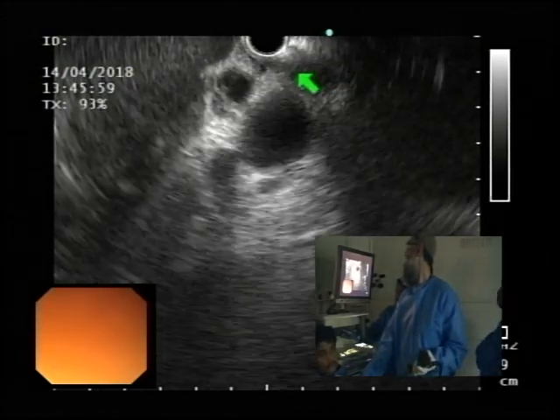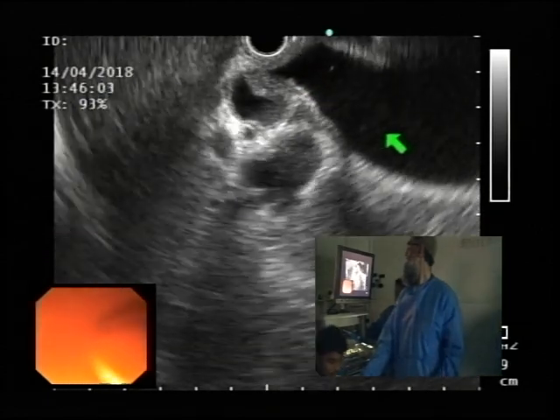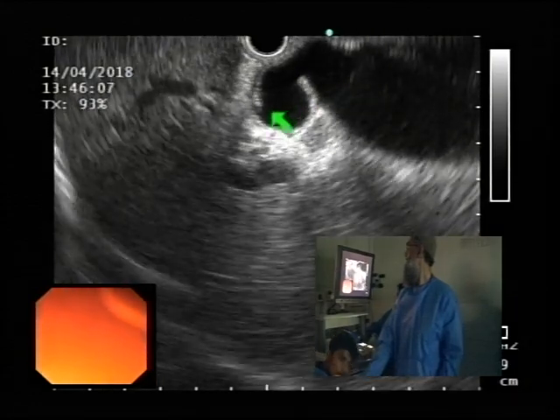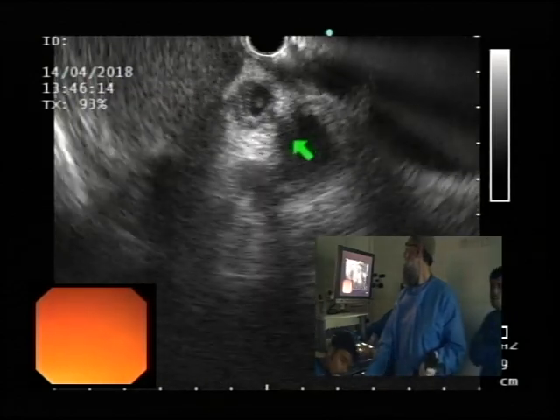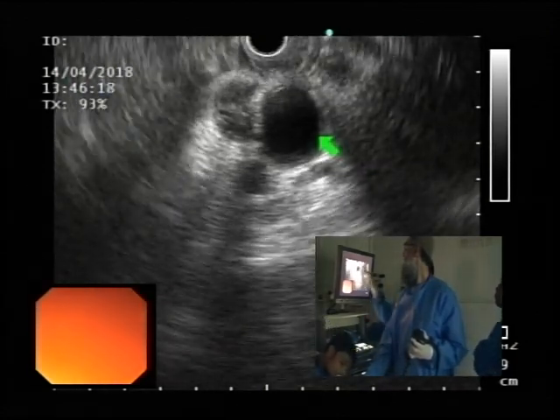liver. So when you go counter, you're going towards liver. So that's your gallbladder. This may be the cystic duct because it's communicating with the gallbladder, and you're starting to see liver. Now go clockwise, and this is your main common bile duct coming into view. Keep going clockwise. Now suction and go.